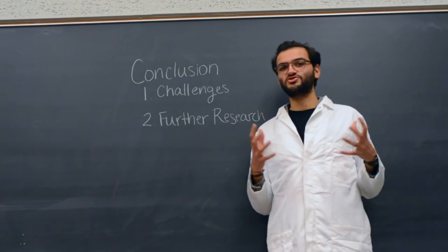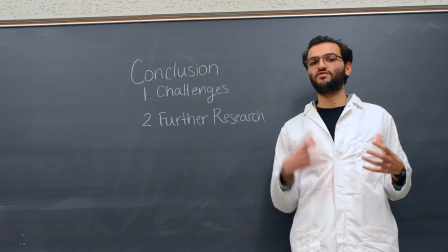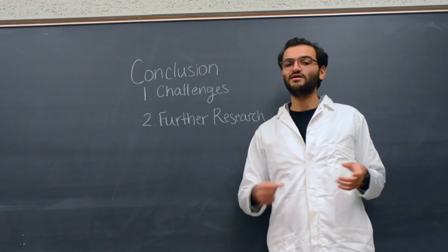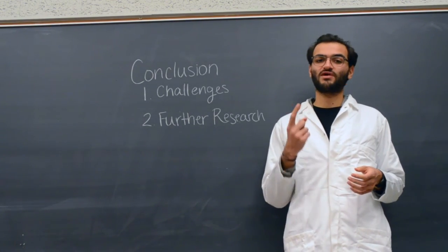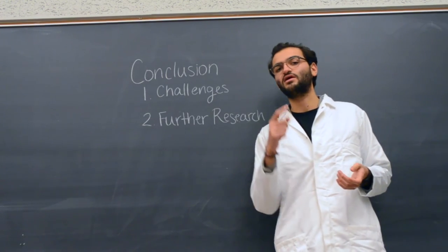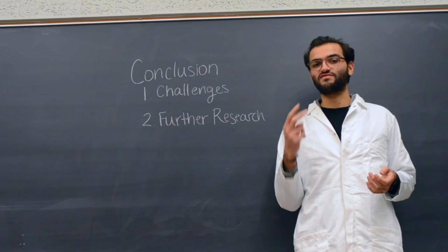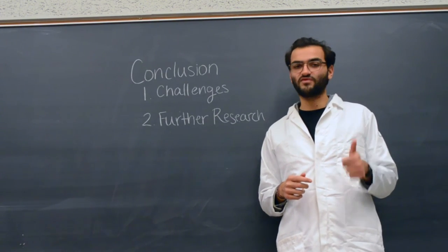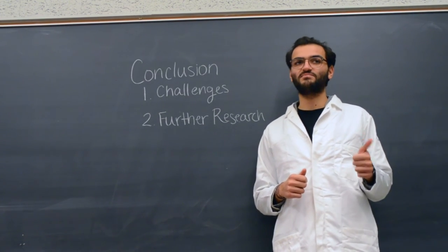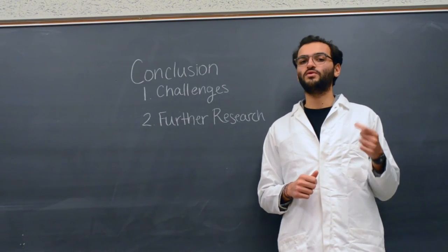So far, all our research is preliminary. We still have a couple of challenges to overcome before we can have a good working model. First, we need to figure out an ideal and pragmatic spacing of nails so that it can be manufactured easily and accomplish the outcome we desire. Further, in order to refine our model, we need to know the types of forces present in that area of the body and the types of cells and their properties and hone in on that.